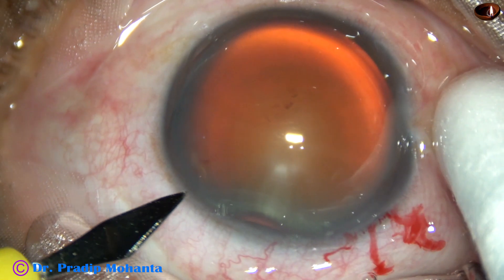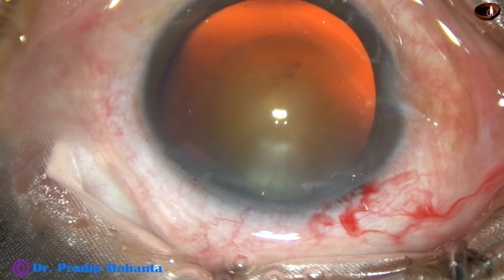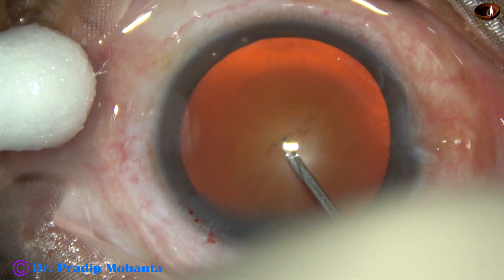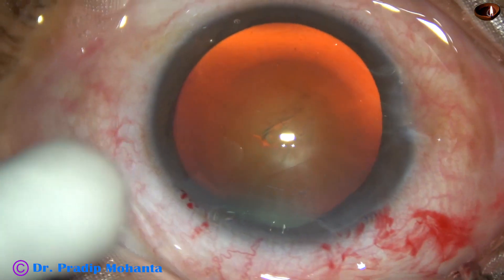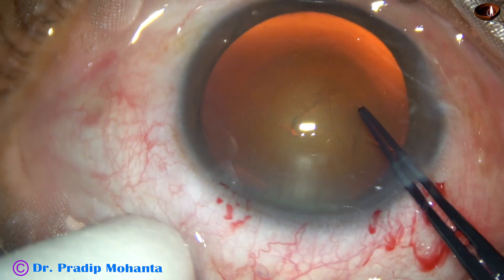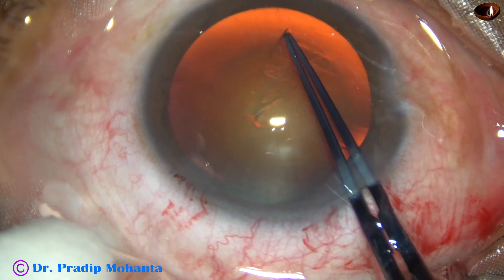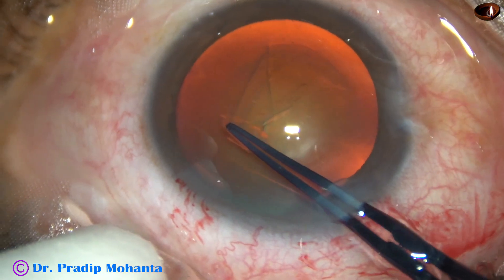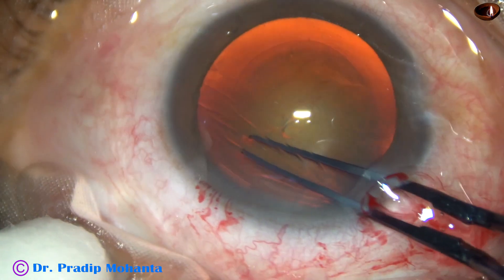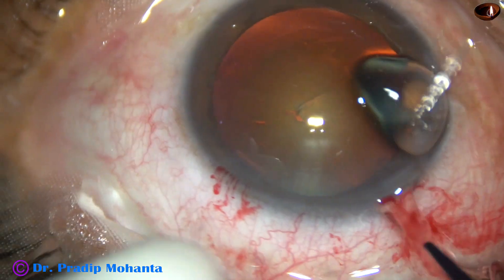This is a side port on the left side of the main incision, about 2 clock hours away. This is how I do capsulorhexis. I create a capsular tag with a needle and then hold this capsular tag with a utrata forceps, going anticlockwise remaining at a certain distance away from the margin of the dilated pupil, and thus I get an optimum sized rhexis.